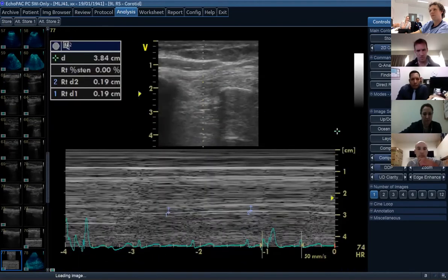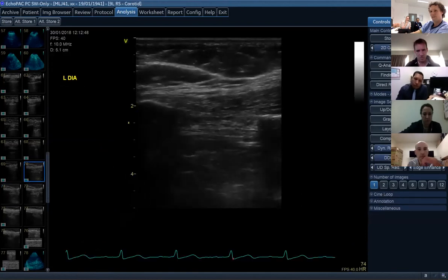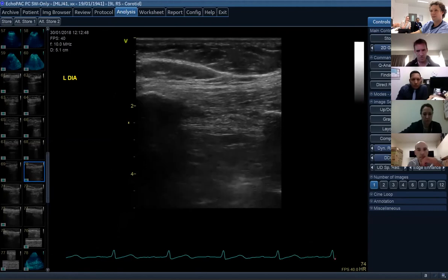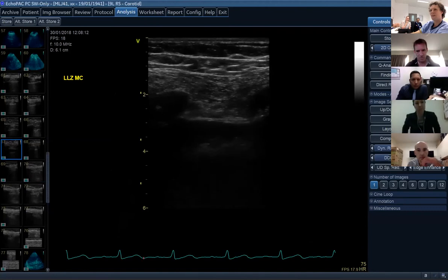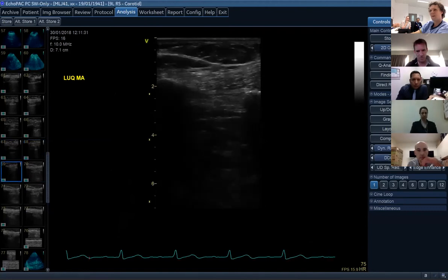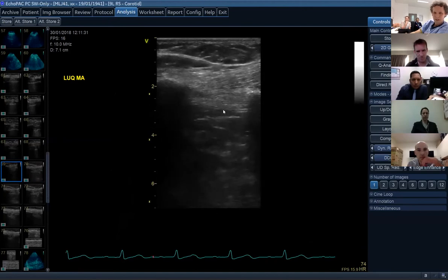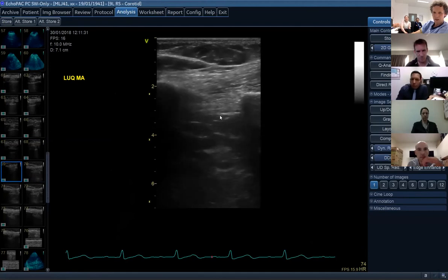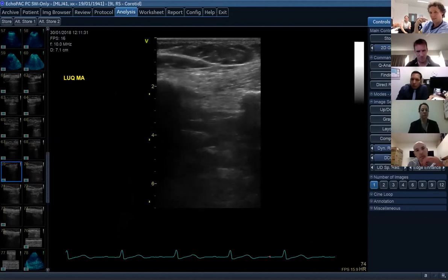But if you have a look, sorry, let me go back. Now, this is the left diaphragm. I don't know how well this comes out for you guys. I'll just see. Yeah, this is the best one I got. So these two lines here are the same that we were looking at on the other side of this guy's chest. And first of all, if you measure it, you can see that it's a lot thinner than it was on the right side. So the right side was about 3 millimeters. This one's just about 1.5.